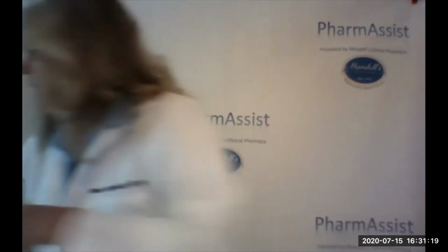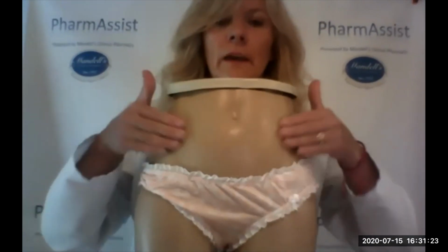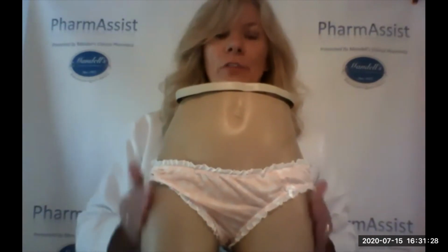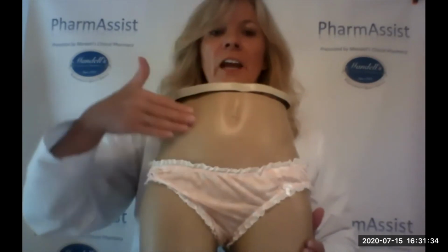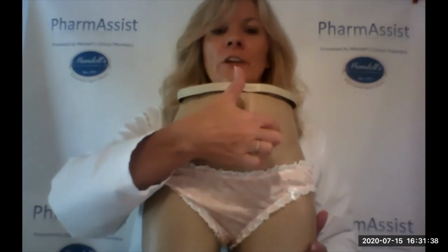Where it is that you're going to administer, I'm going to get my little mannequin here just to show you that you are going to give the injection. It's going to be in either the lower belly, or the upper thigh area and side outer thigh area. No area is better or more efficient or more effective. The little fatty area in here is fine for this medication.